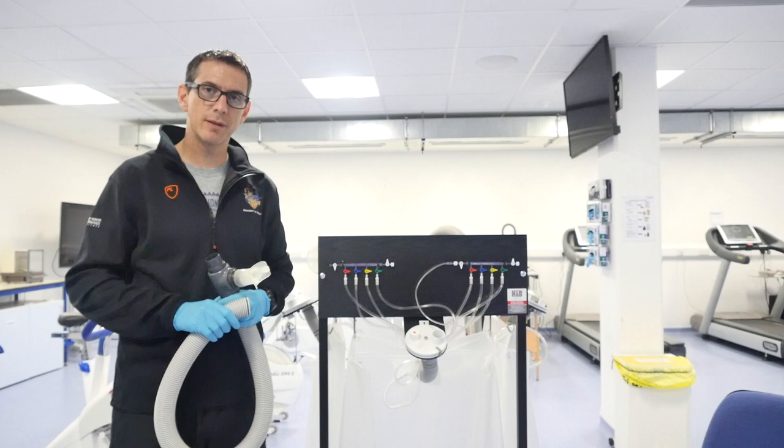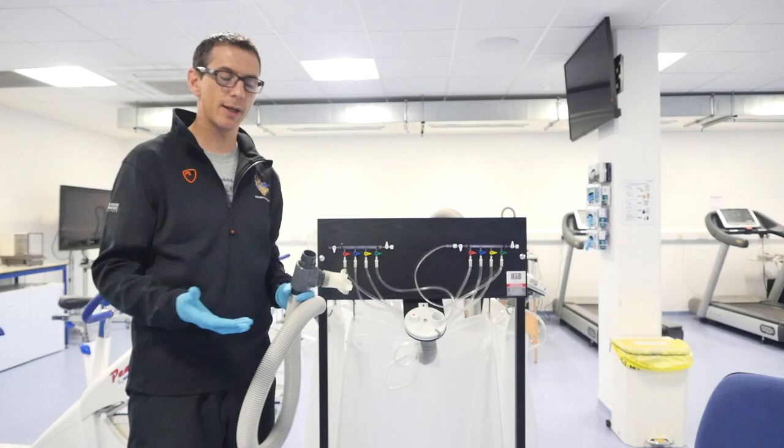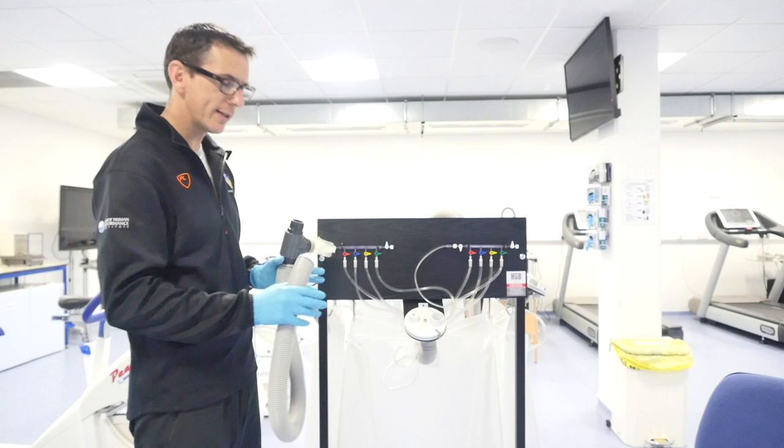Now we're ready to connect this to the Douglas bag. This is the Douglas bag system - these are the bags we use to collect expired air. Within these bags, we can put the concentrations of oxygen and carbon dioxide into an equation, and we can calculate VO2, fats, carbohydrate oxidation, and a host of other measurements. So what I'm going to show you is, once we've put the mouthpiece together, how we collect the expired air.